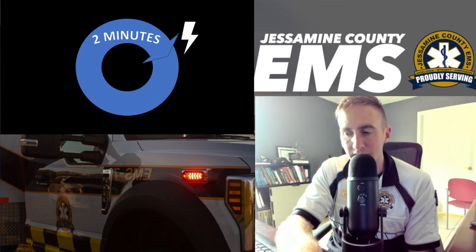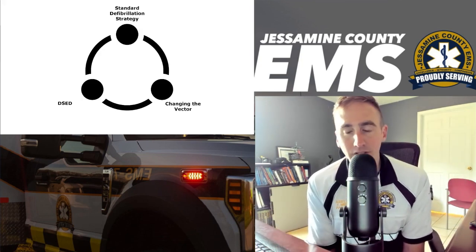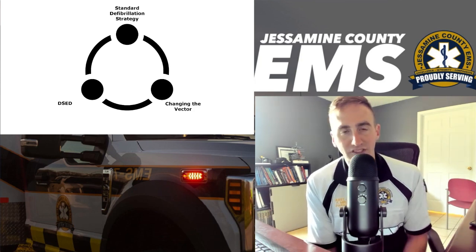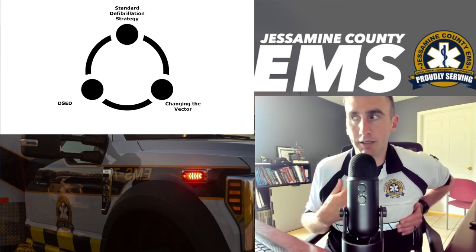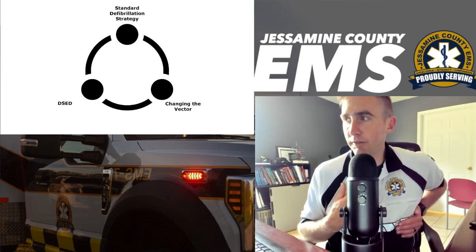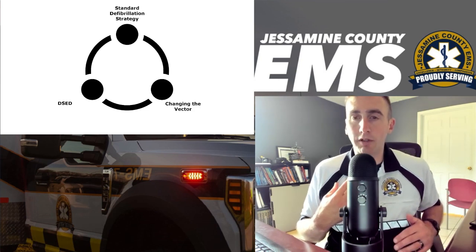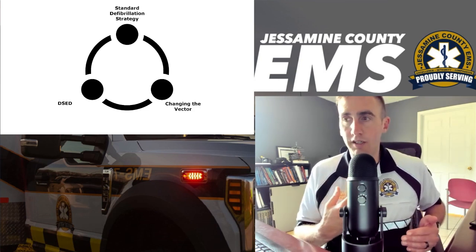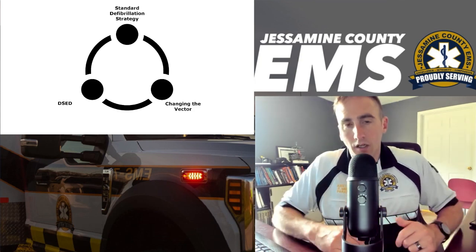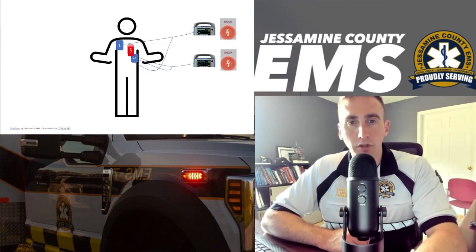So what is that thing? That thing is dual sequential defibrillation. There are different strategies that have been looked at in the literature for defibrillation. One is the standard anterolateral. I know it might look backwards in your video, but it's not. And then the strategy we've been deploying, if that didn't work, is changing the vector. So put a pad here, and then on the back. There's another strategy called dual sequential external defibrillation.